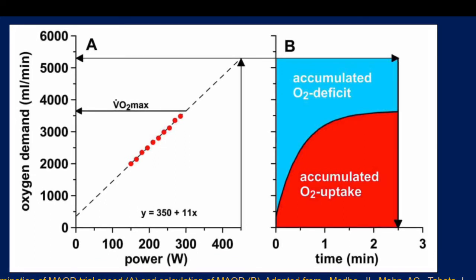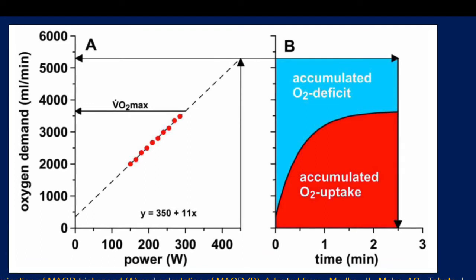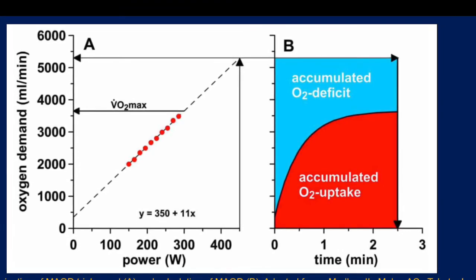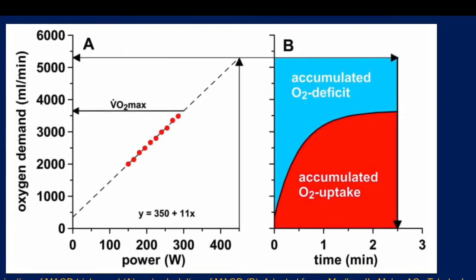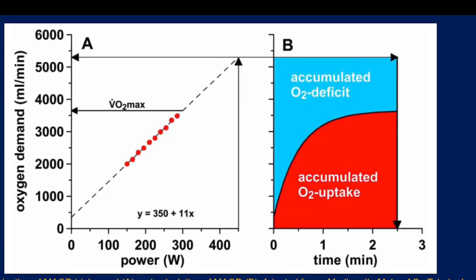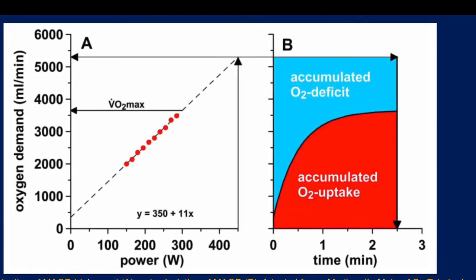We then come to the third issue, which lies in the actual exercise intensity that we prescribe. One of the things that is really understood is that the intensity that we do these trials at has to be set, based upon the Medbo paper, anywhere between about 110 to 130% of VO2 max.